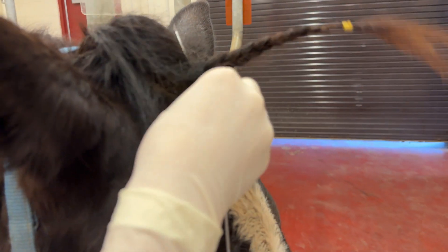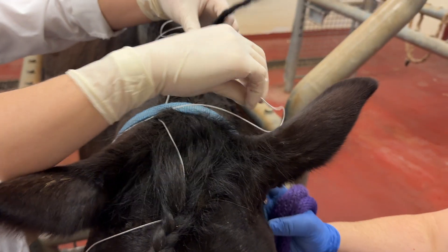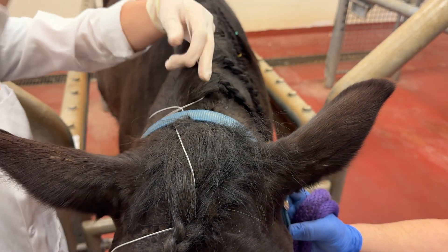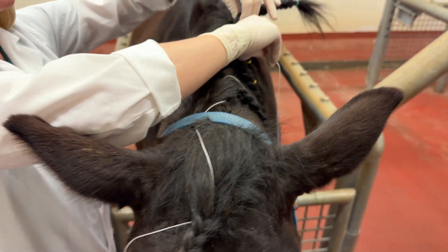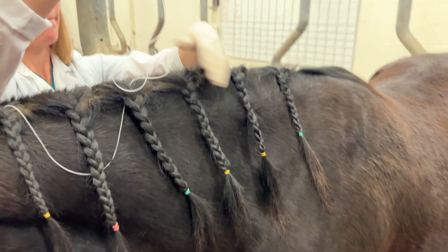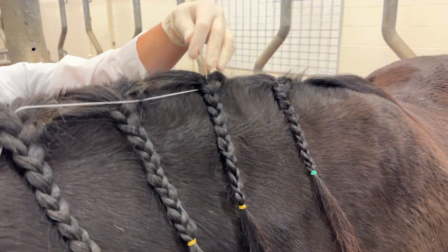Now you're going to weave the whole lavage line through the forelock and then the mane. If you don't have a mane to work with, which is not common, you could place little tags with some suture as well as tape along the side of the neck that you can then weave the lavage line through.